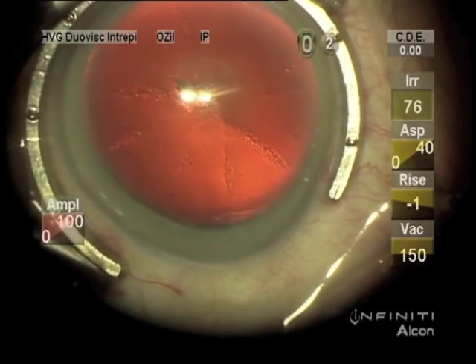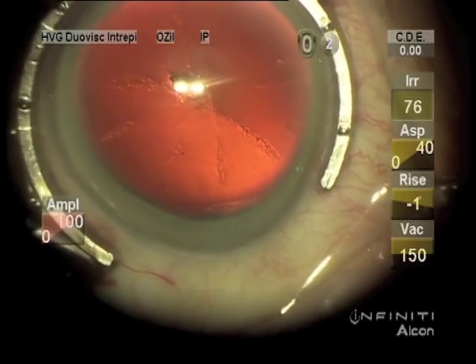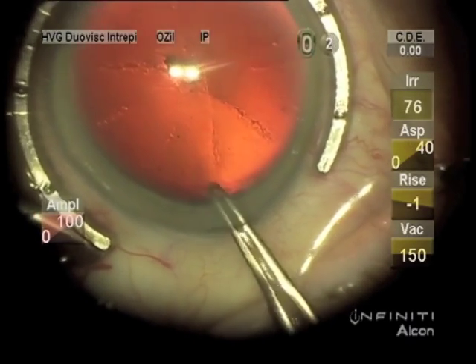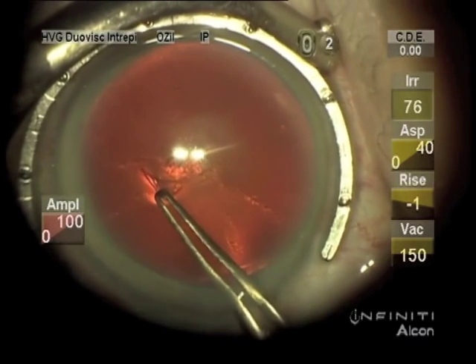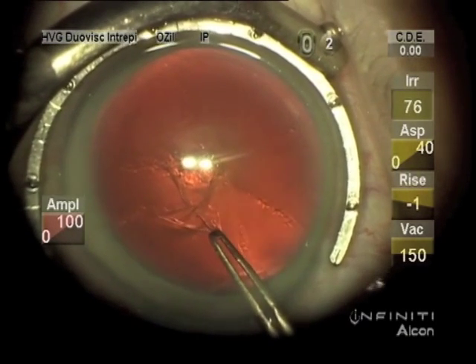This happens to be the irrigating cystotome that we first used before viscoelastics were available, but it does the job.